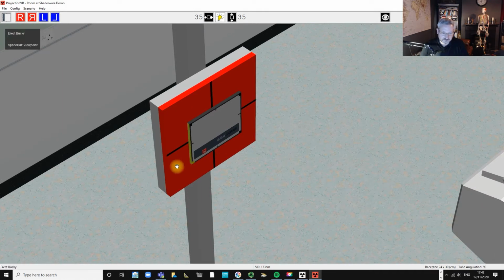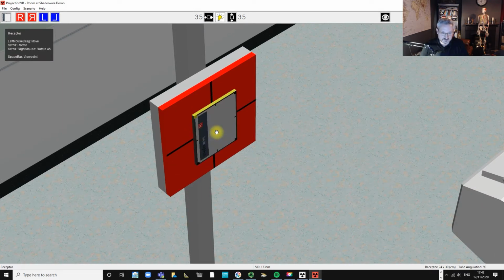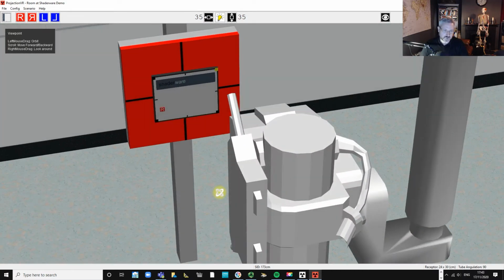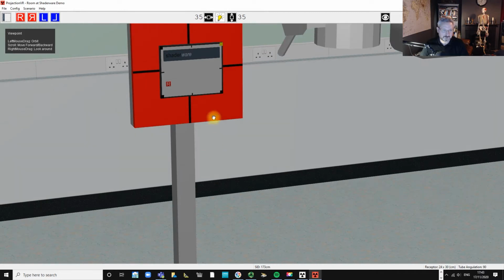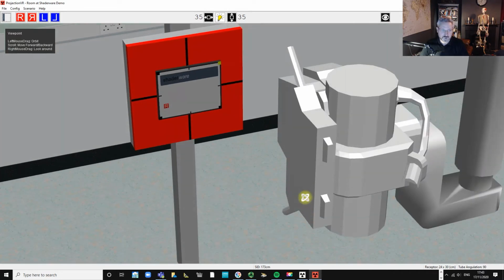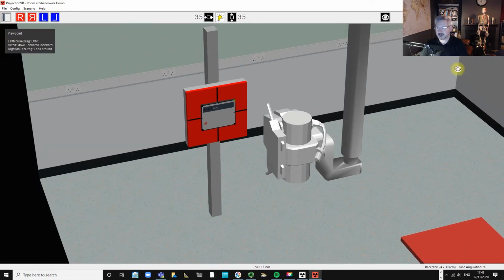That makes the point also. I've got the yellow dot at the top. I need the yellow dot at the top because if the patient stood there facing us, this is going to be their right side. This is going to be their middle line. So we want the marker. I usually try and put the marker on the lateral aspect, so that's where I'm going to put the marker. So I think we're okay there. Just position that square. So I think I'm as prepared as I can be there, so I'm now going to bring our patient in.